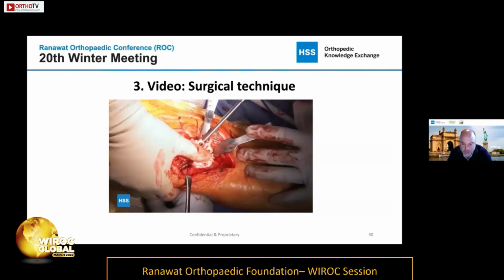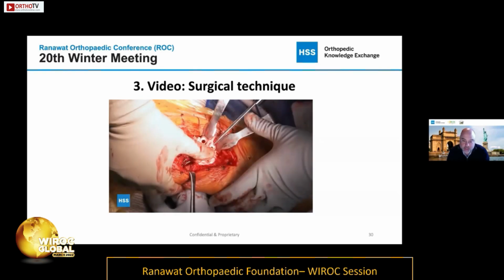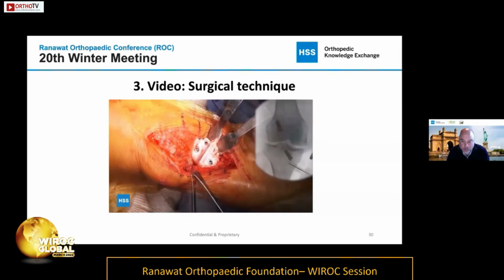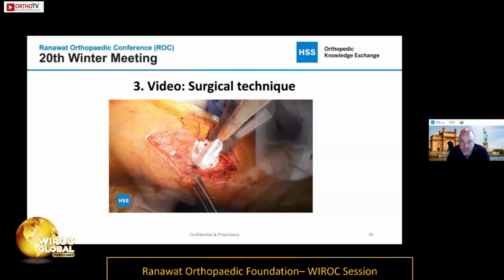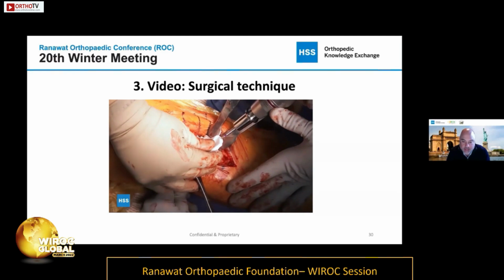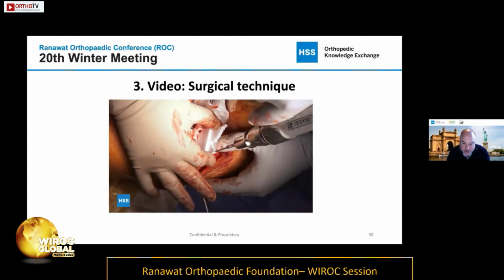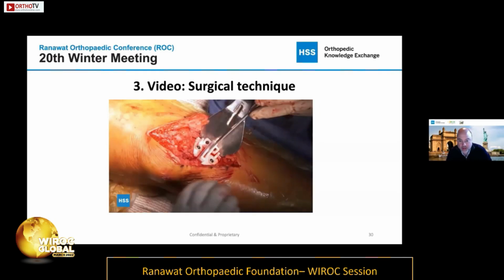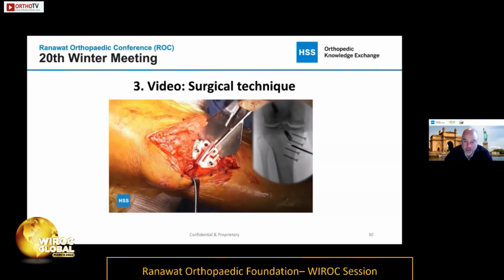Once this is rigidly fixed, you take one quick x-ray to confirm where you are. There's a calibrated box in there to open the wedge. I'm confirming the plane of my osteotomy right there with the x-ray. And then this is the drill bit sleeve. At this point, I almost can leave the room and let the residents do the rest of the case, because you can't hurt the neurovascular structures because these are all calibrated. You can see the different depths here. And you can see there's no saw, you're not cooking the bone. And then you finish it with an osteotome.